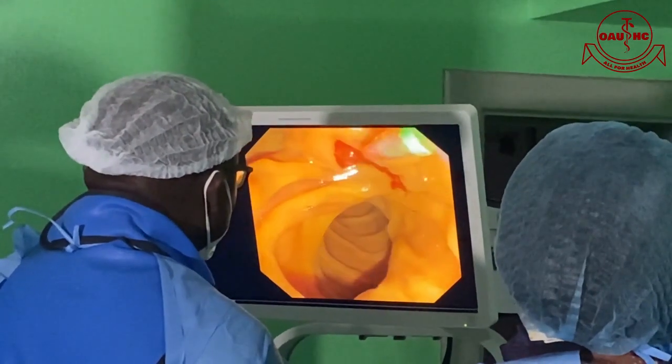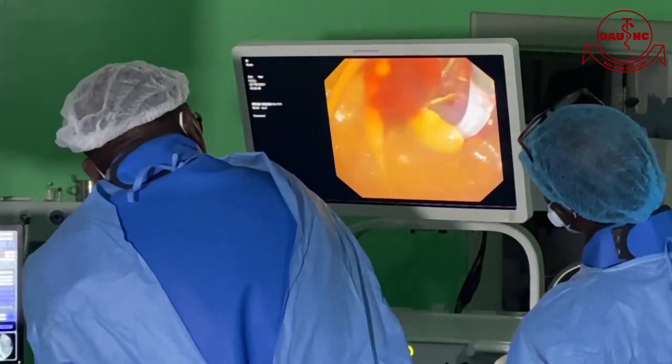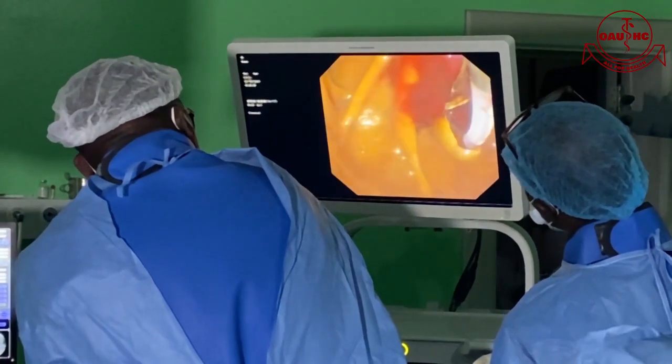But since we introduced ERCP, we've been successfully able to stent many of them and give them real hope. The majority of them present with terrible itching, so bad that it prevents them from sleeping. Since we put stents in there, the itching disappears, and we can give them other remedies to help them and prolong their life. This is one of the things that we pride ourselves on, probably the only institution offering that in Nigeria, and we hope we'll be able to do more along that line.